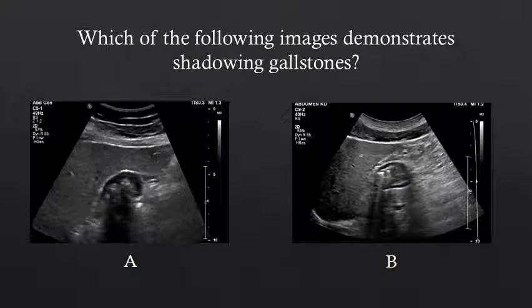Take a second to look at these two images. Which of the following images is showing shadowing gallstones? This is a tricky case. Image A shows shadowing gallstones and image B shows gas within the stomach. Notice that in image A, the gallbladder has a single-layer hyperechoic wall, whereas in image B, there are three layers to the gastric wall.